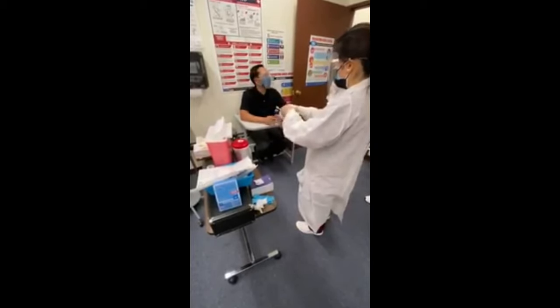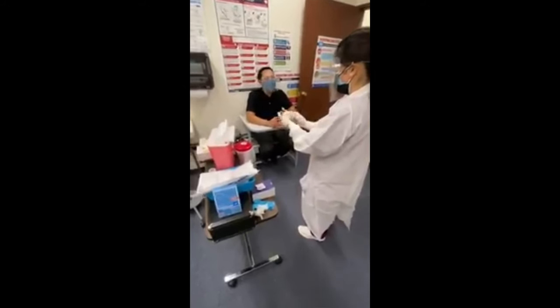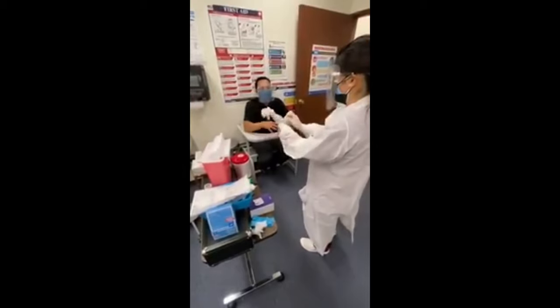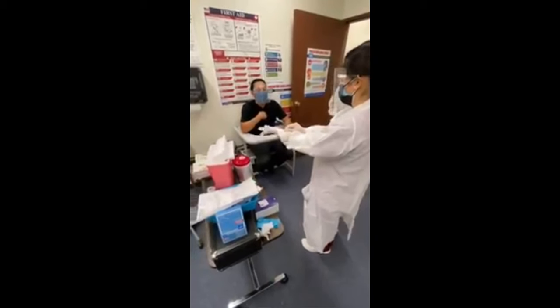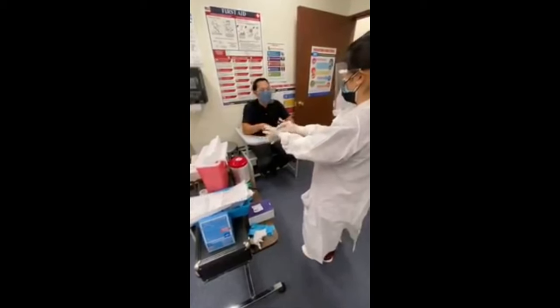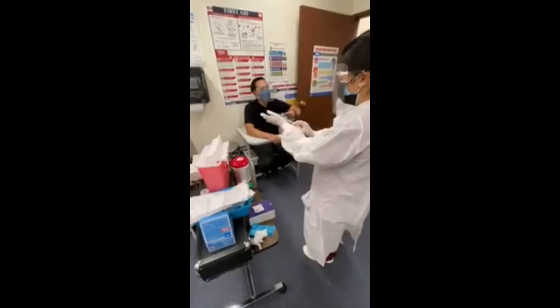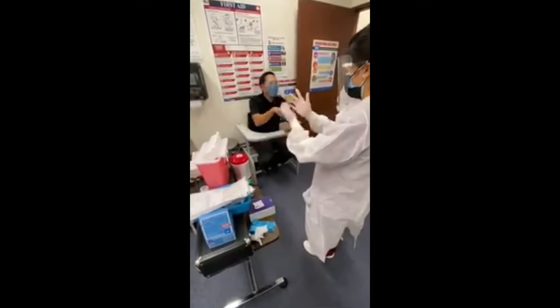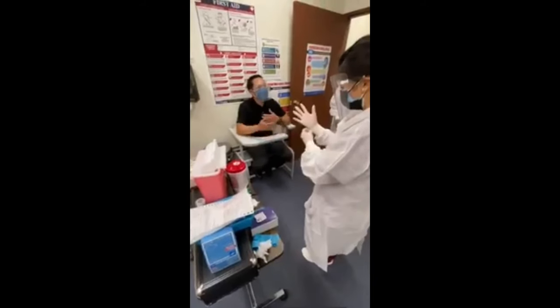The gloves, right? Use one size smaller when you feel. Yes, smaller. And as you get used to it, you could skip this whole process of not wearing gloves to feel. So how I normally do it, since I'm so used to feeling it, once I verify the patient, I put on gloves right away. I put on a tourniquet, I feel, I sanitize, wait for it to dry, and then I stick. So it just cuts it in half.